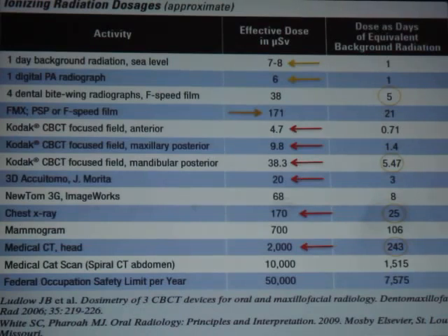So it doesn't mean that every patient we see will do a conebeam CT. We still need to justify that the patient requires a conebeam CT, and that it will help the diagnosis or the treatment and the overall management of the treatment.